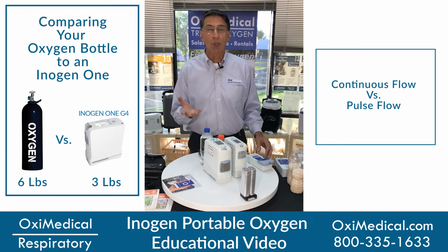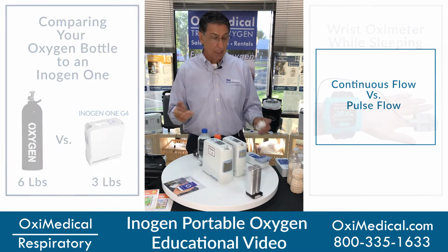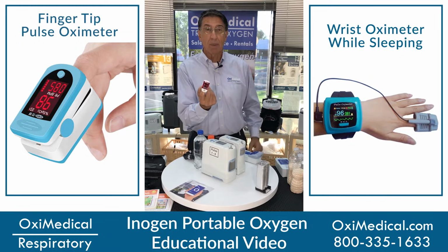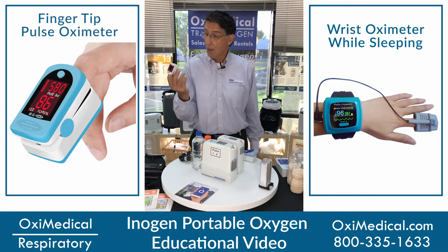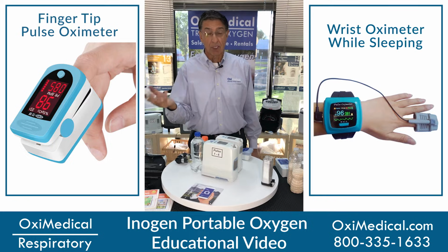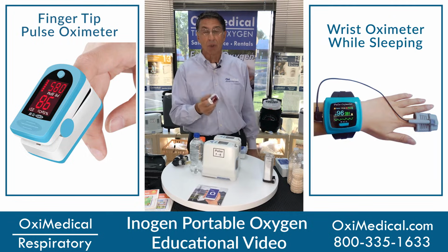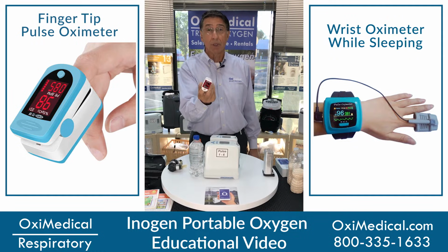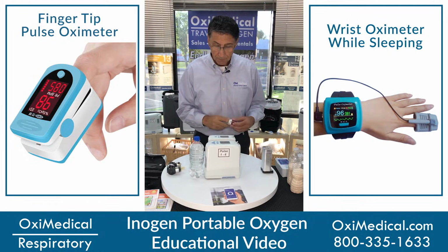But how are you assured that you're going to maintain that oxygen level? Well, you need a fingertip pulse oximeter. So if you're going to use either a conserving device on an oxygen cylinder or a portable oxygen concentrator, get yourself a fingertip pulse oximeter, and you can also check your heart rate with it.